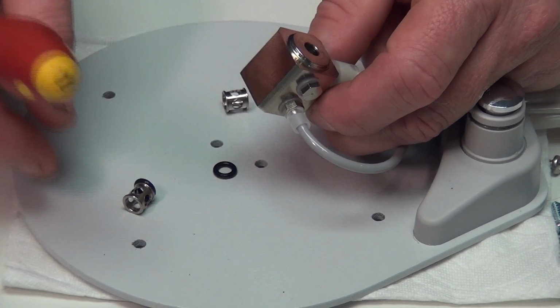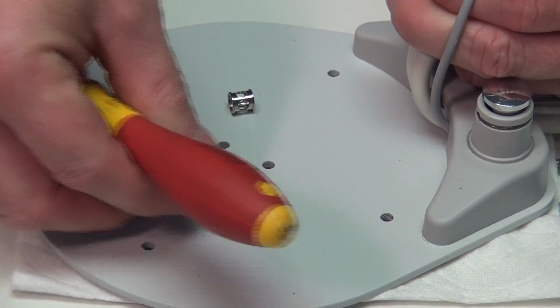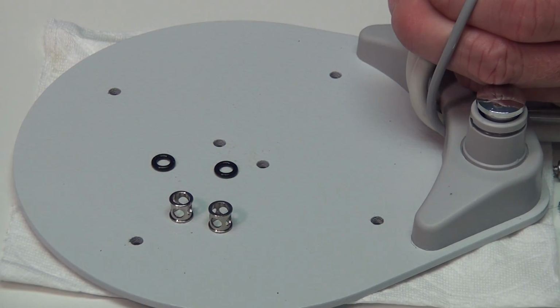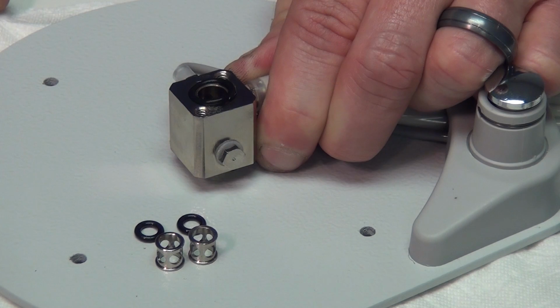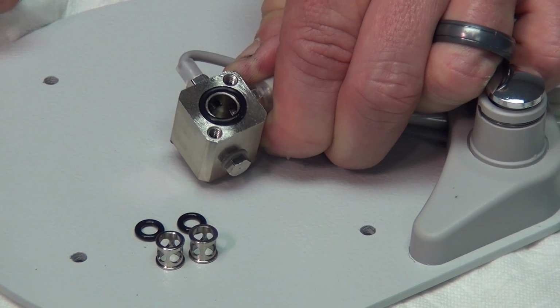And we want to pop out 2 black O-rings and then 2 metal barrels. Once you've removed the 2 metal barrels and the 2 small black O-rings, remove the larger black O-ring from the bottom.